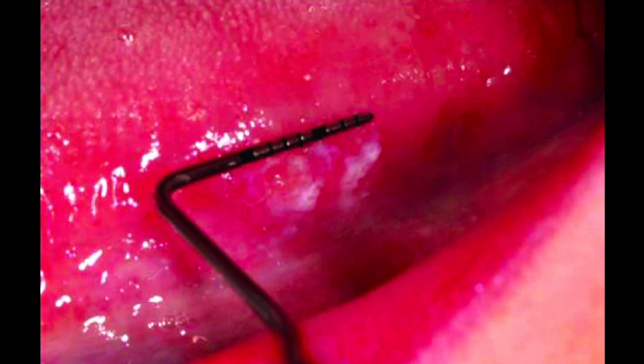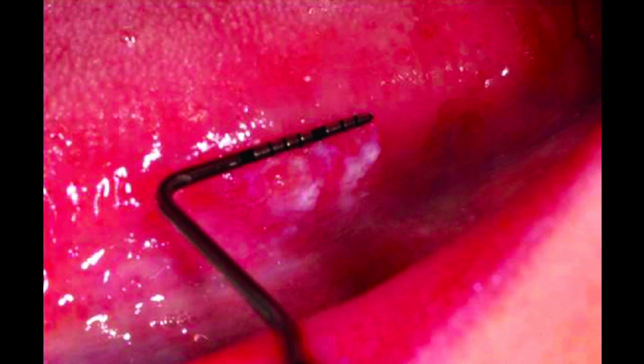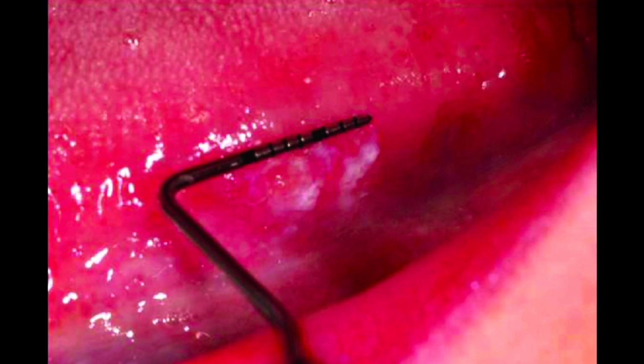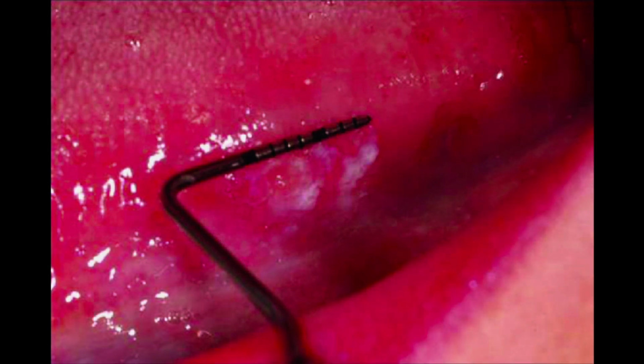And lastly, I just want to finish up by talking about the other use of the probe, which is to measure lesions inside the mouth and outside of the mouth. You are also able to measure the open contact. First, you would check with floss to see if there are any open contacts. If so, you could use your probe and measure that.